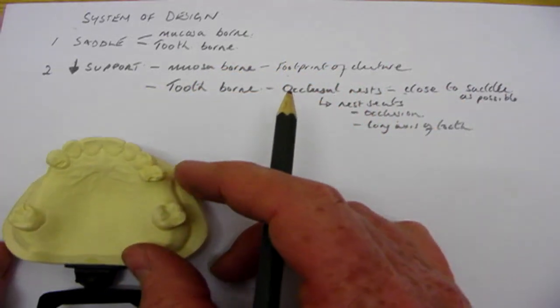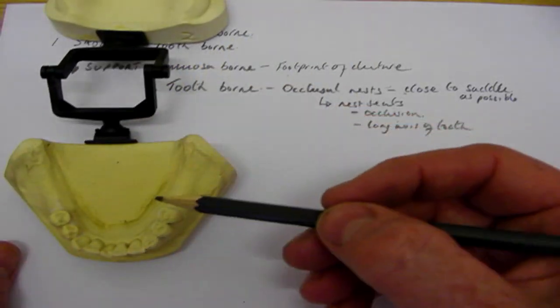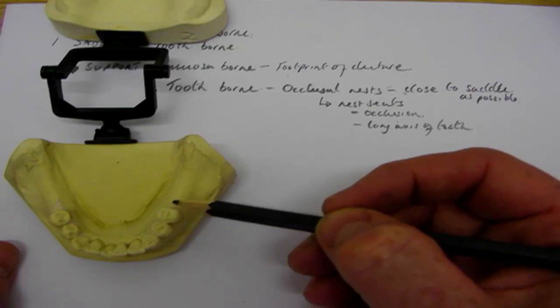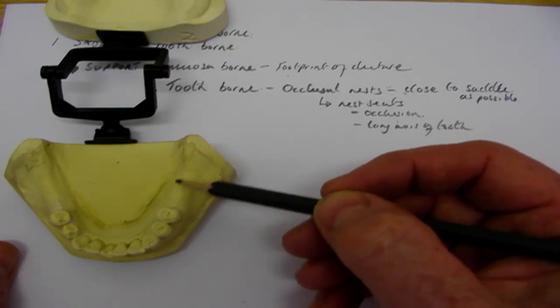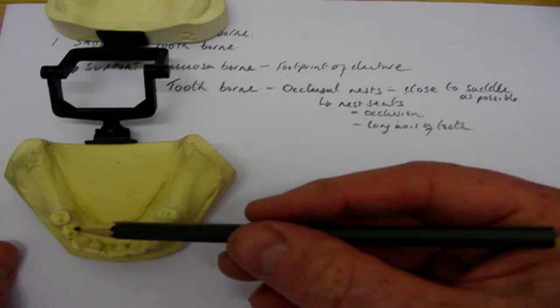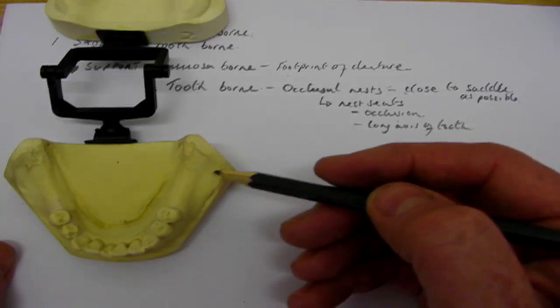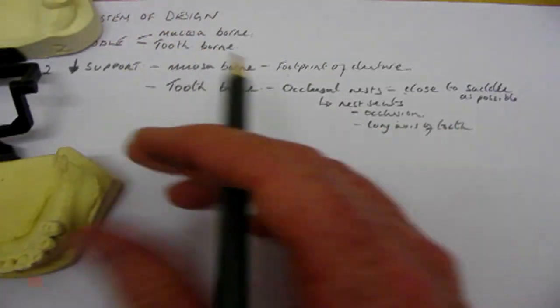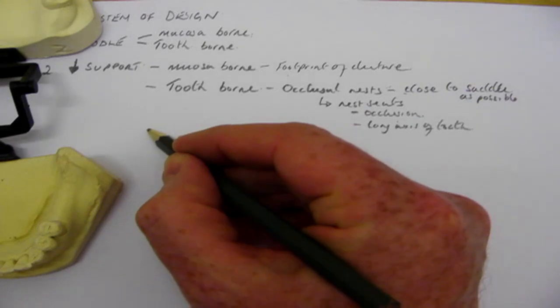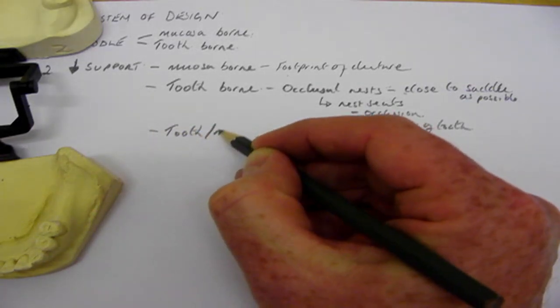If we're doing a tooth-borne denture where there's a free end saddle, then this part of the denture is going to be mucosa borne. No matter how many occlusal rests we put on these teeth around here, this is going to be a mucosa borne part of the denture. So really this is a tooth and mucosa borne denture.